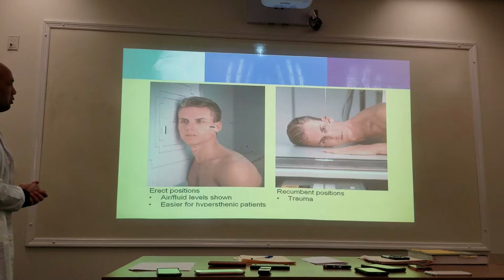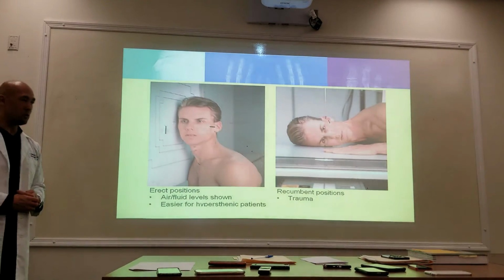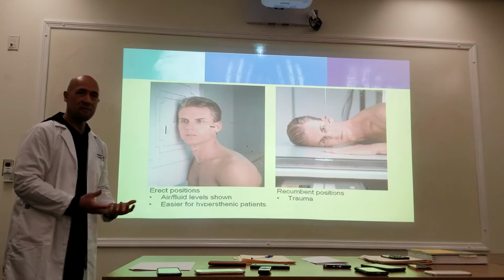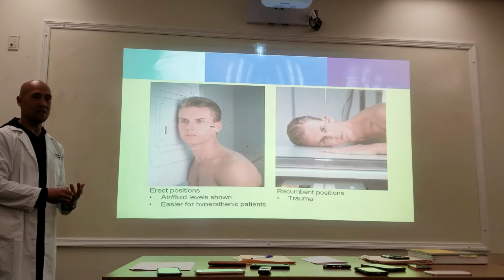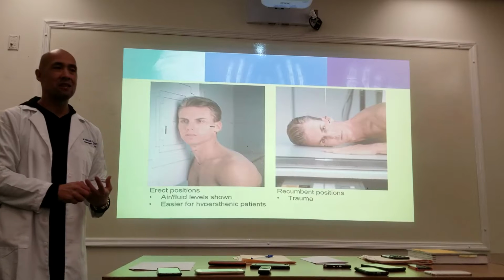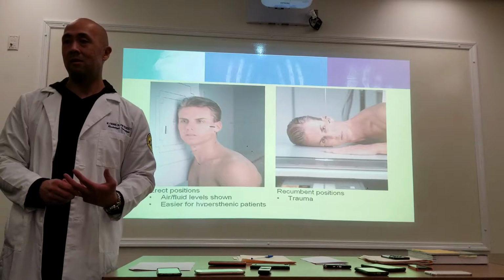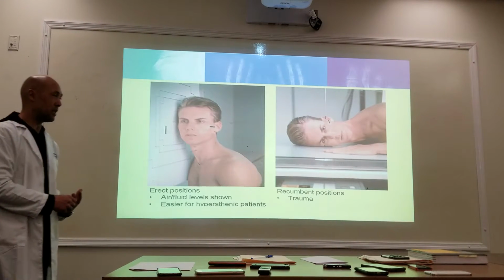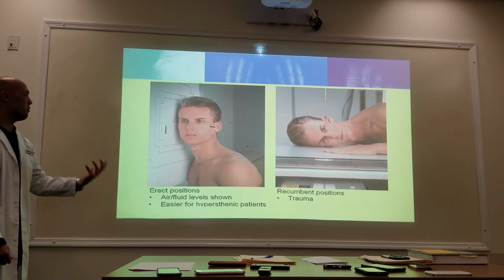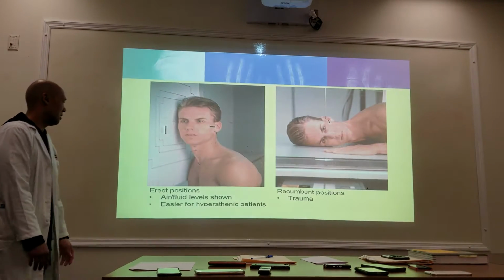This is referring to, do we choose to do it upright or do we choose to do it supine? Generally, if it's skull, you can do it either way. But now if we're looking at the facial bones and the sinuses, we would like to do them in an upright position because fluid levels will indicate there may be some injury within the skull that we can't see radiographically. If they're sedated, if they're traumatic, if they can't move for you, then of course doing it on the table would make a lot more sense.